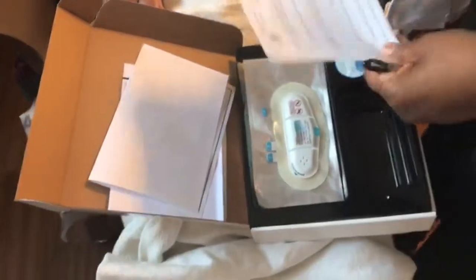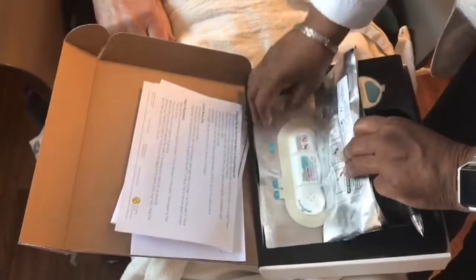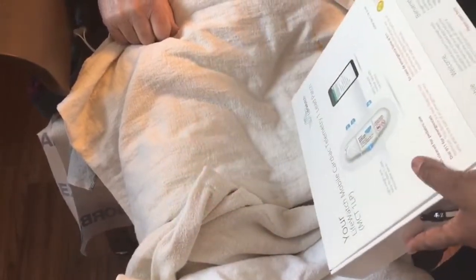LifeWatch will most likely call you to say they're not getting a good signal. These are extra pads, and he has to take the kit with him when he comes back for his post-op appointment so they can change the patch in the office. They'll just take the patch off and put the monitor in the new patch. They change this patch every seven days.